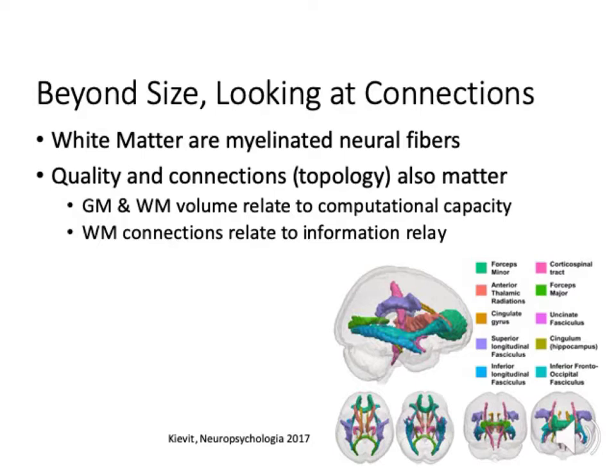Next, a general linear model that tries to predict typically the density of fiber tract connections or individual fiber tract connections as a function of various kinds of covariates and factors must be created. And finally, statistical hypothesis testing should be performed to test the significance of this model.